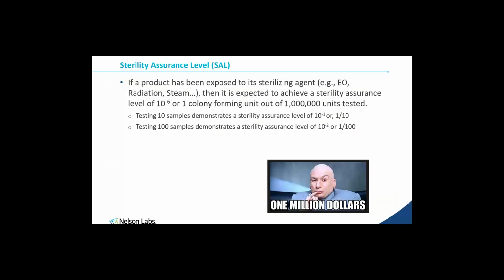So whenever we talk about sterilization, what we're really talking about is usually terminal sterilization. And we also are going to touch on the pharmacopoeias and what that means. But for the most part, when we say sterility, what we're actually talking about is a sterility assurance level. Nobody likes saying sterility assurance level over and over again, so we refer to it as your SAL.